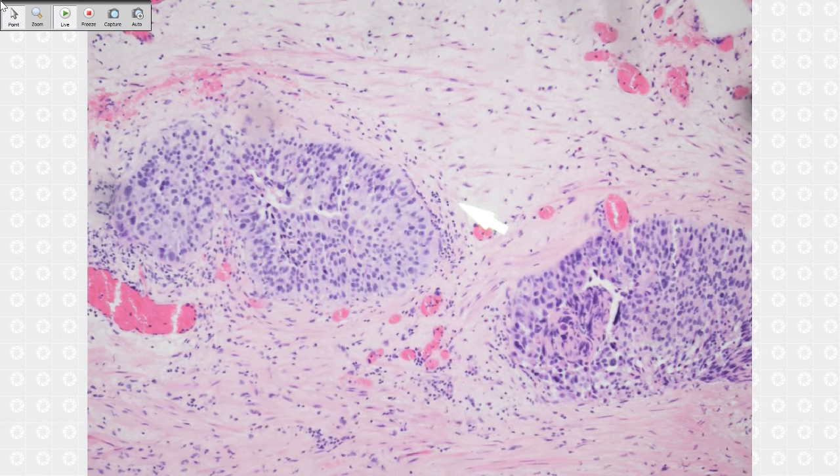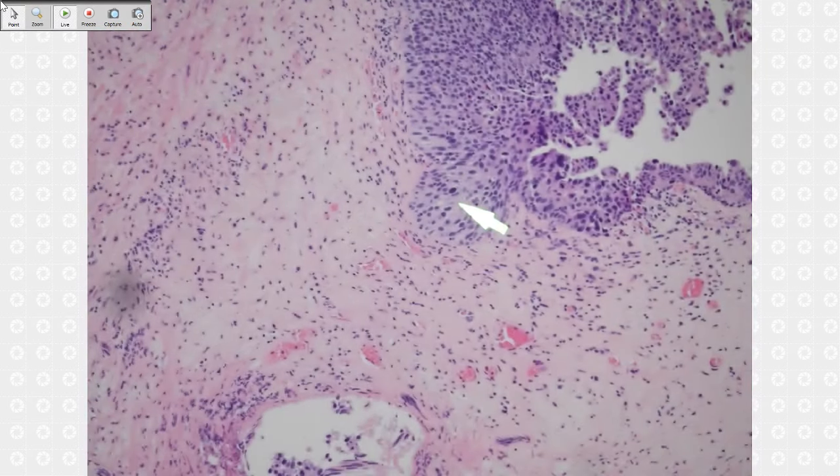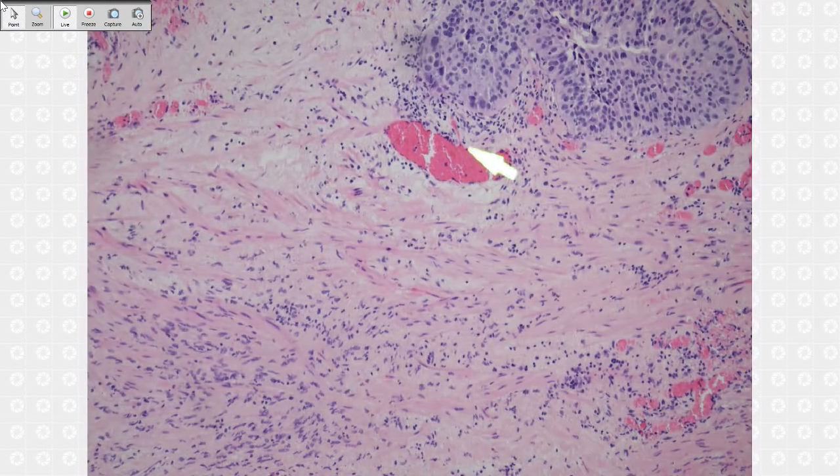What about the perivascular area? It seems like some cells are going around the vascular channels, on the opposite side of your arrow. Do you mean going to the vessel? I didn't see a vessel. I think it's congestion, with a tendency toward dilated vascular channels. Which focus?